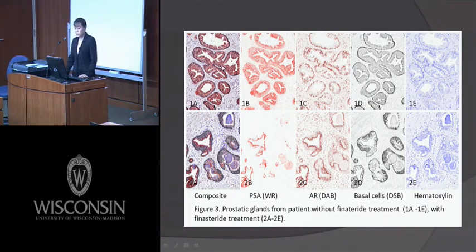This is a composite image. The bottom one is a patient sample treated with finasteride. This one is from a patient without finasteride treatment. You can see by morphology there is a difference.